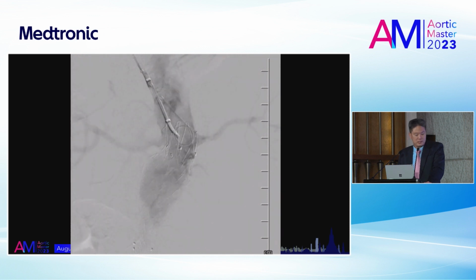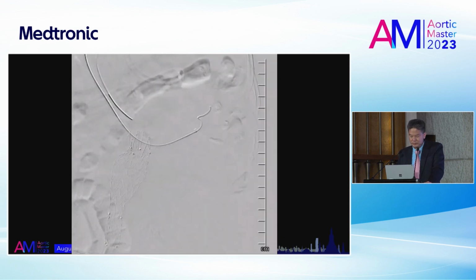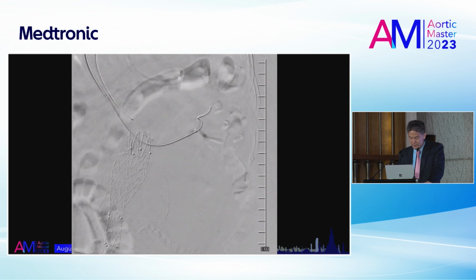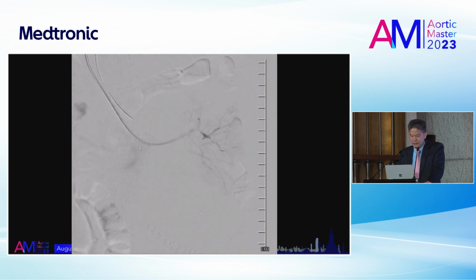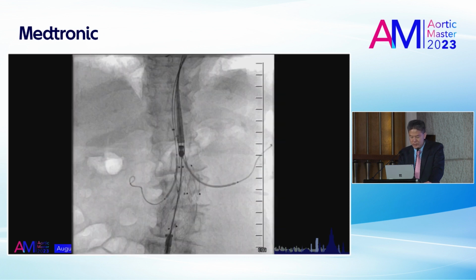You see we're trying to, Dr. Natisakan came and helped us, and Dr. Apinan selecting the left and right renal arteries. You see we could get a cannulation right there. The left renal artery, the right renal artery.